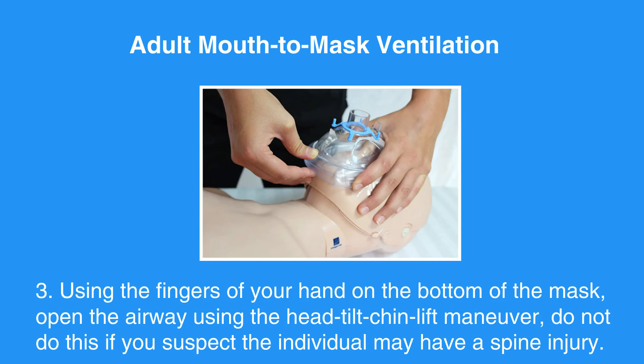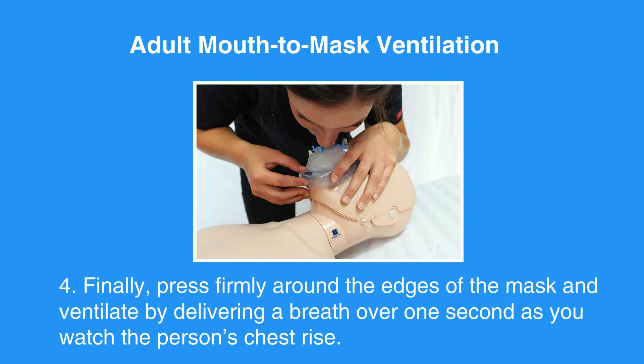Do not do this if you suspect the individual may have a spine injury. Finally, press firmly around the edges of the mask and ventilate by delivering a breath over one second as you watch the person's chest rise.